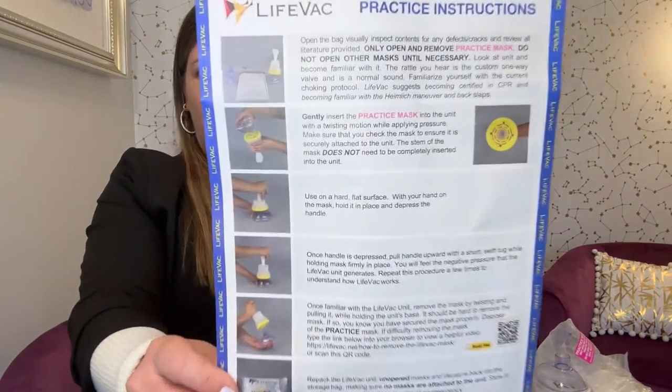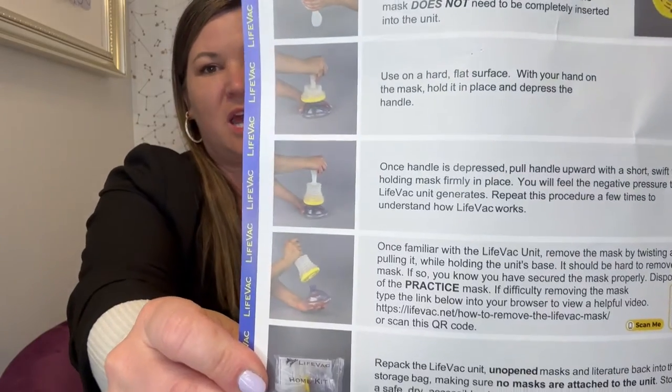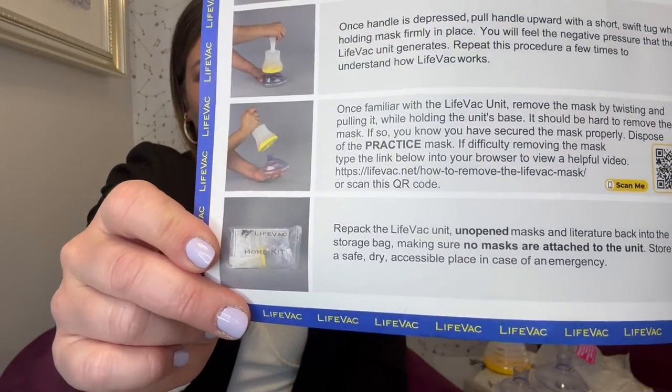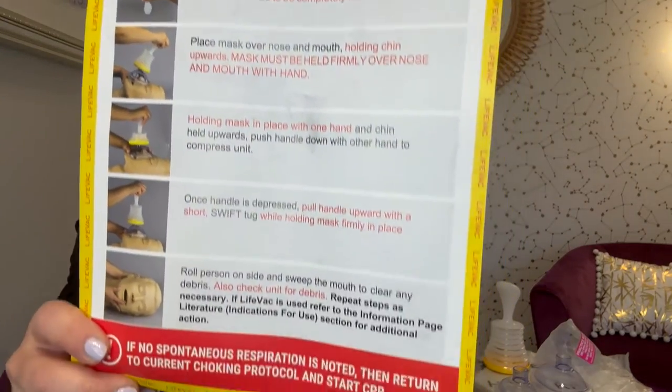Life Back also comes with practice instructions showing you how to assemble it, how to use it, and how to attach the mask. It also comes with actual instructions for use — there's a card here, and there are videos that show you.